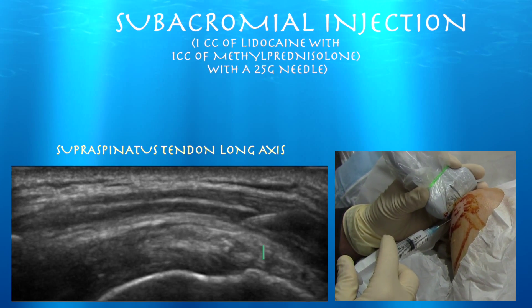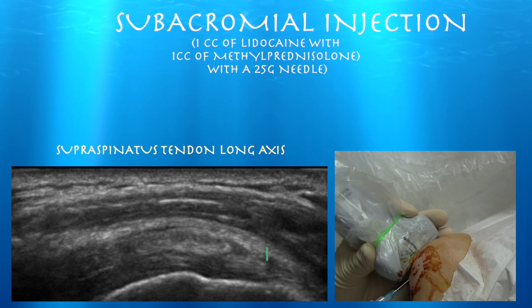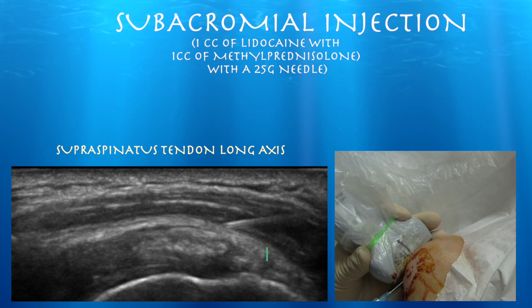It's really a very little sliver that you're trying to get the needle under — you don't want to inject into the deltoid muscle itself. There's a thick band of hyperechoic tissue above the supraspinatus tendon; that's really the interface of the deltoid muscle with the supraspinatus tendon and subdeltoid bursa. The subdeltoid bursa is essentially under that hyperechoic band, usually just a thin strip in someone who does not have bursitis.